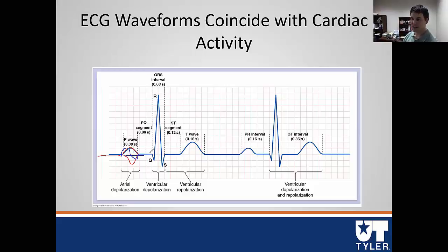Then we have this pause that's anywhere from 0.08 to 0.1 seconds. It's a very specific time. Again, this is the pause that allows filling of the ventricles, right? We then have this, again, very distinct QRS complex. You just need to memorize what that kind of looks like.